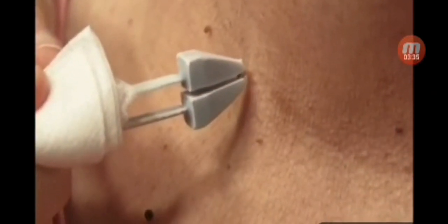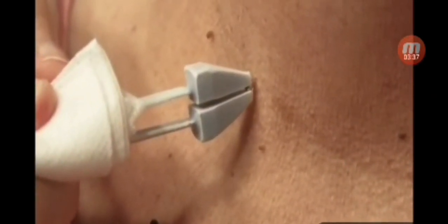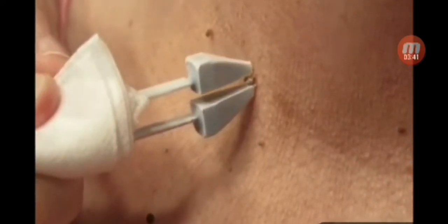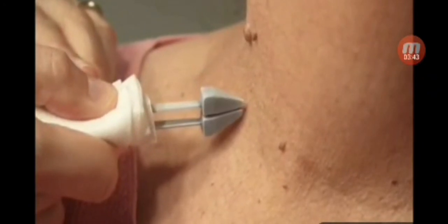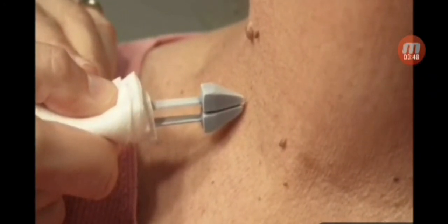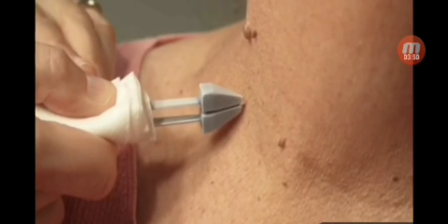In this case, the cryo tweezer is applied to a skin tag in the neck until it becomes white. Note that the cryo tweezer is held with cotton gauze to prevent freezing of the hand of the physician.